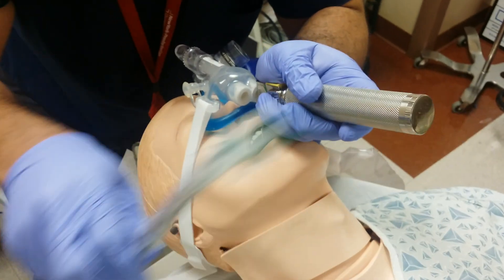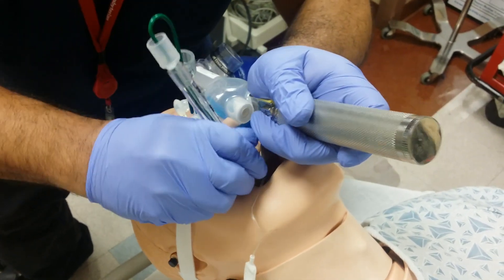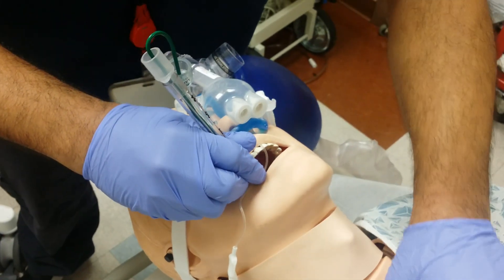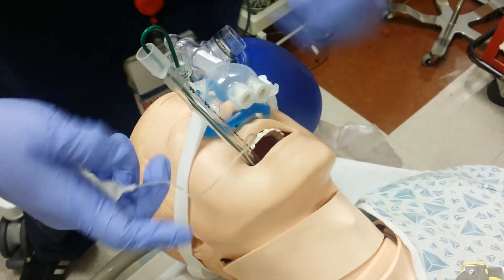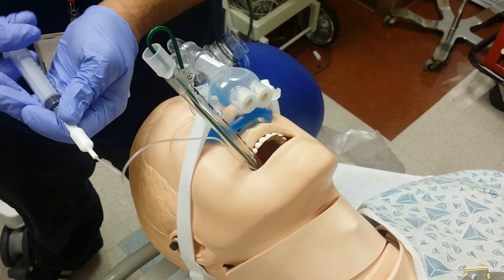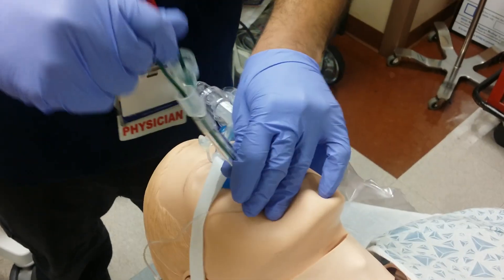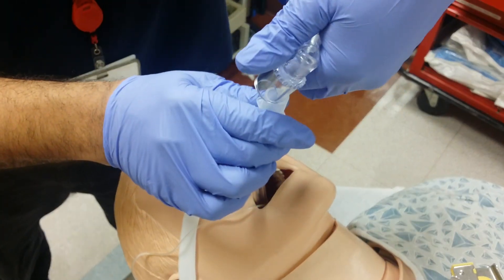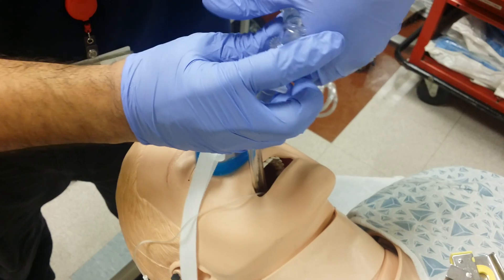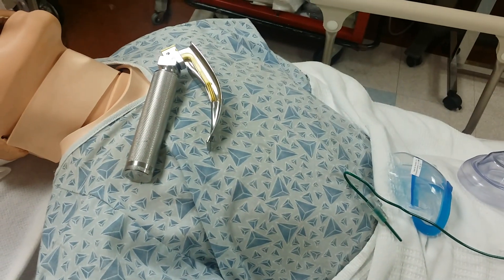Let's see what I see. I will continue pre-oxygenating the patient while he doesn't desat. The lip line is at 22. Inflate. Disconnect this part of the apparatus. And confirm chest rise. Success.